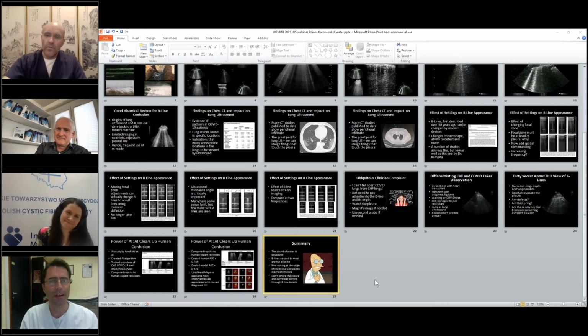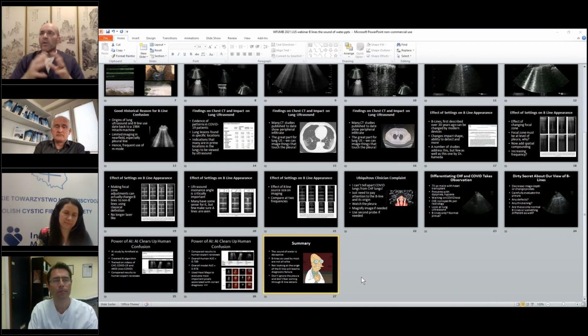Michael, you want to answer? You have an experience in education in ultrasound, sure, but it's also a very huge experience. And these are tough studies to run. Some of the best learning curves we have out there show that at about 25 to 50 examinations, adequate competency starts to show, not necessarily expertise. At the same time, you have real authorities in lung ultrasound that say it's so simple you hardly need to learn it. My experience is if you had to pick one setting where to learn lung ultrasound, it would have to be the emergency department.